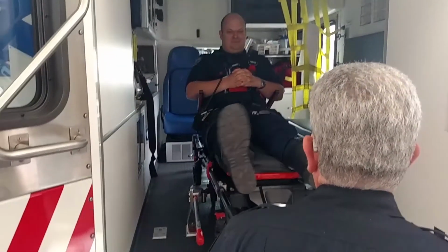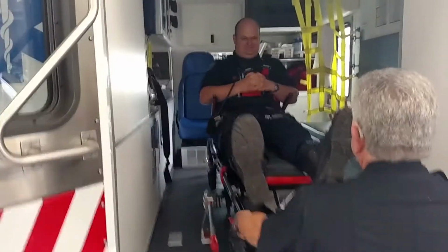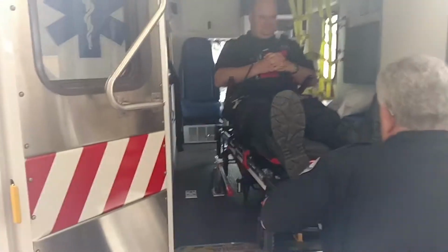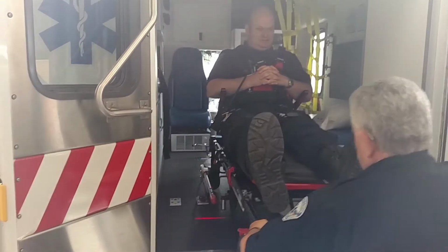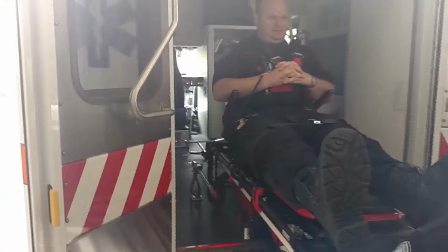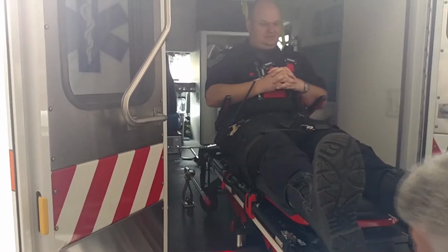All right, bring him out. Except for my big feet in your face. My clown shoes. Okay, now you should go all the way straight out. There's a secondary. Get that laser beam search. Yep. Positive. Not yet. You're not in the hook.